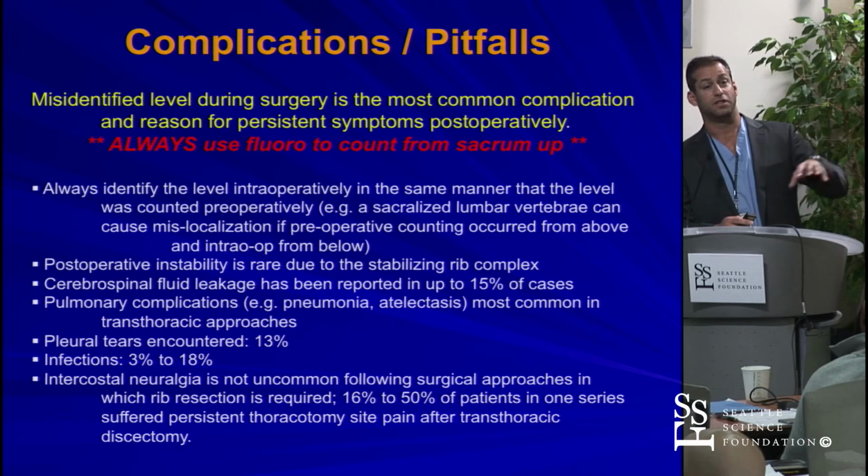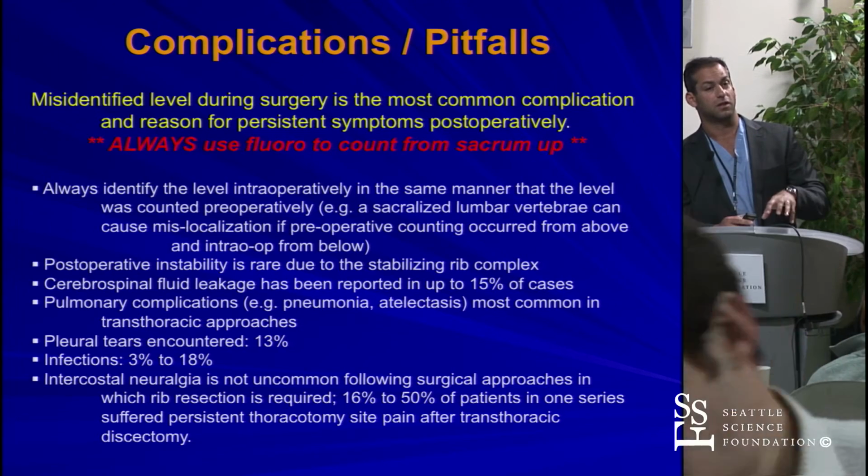You can see it very obviously. But in order to do that, you've done bony work. Right, you've done bony work, but at least you're verifying again that you're at the right level before you've attempted to violate the disc space.